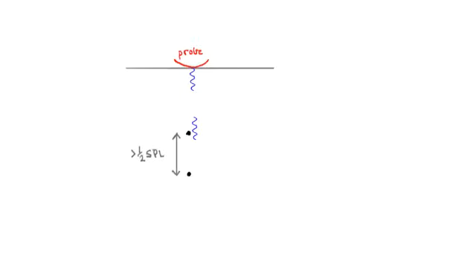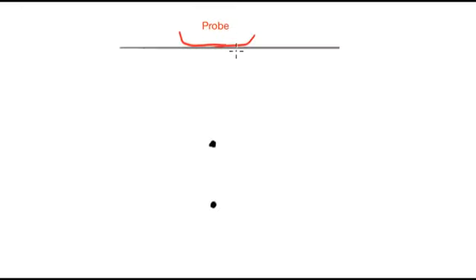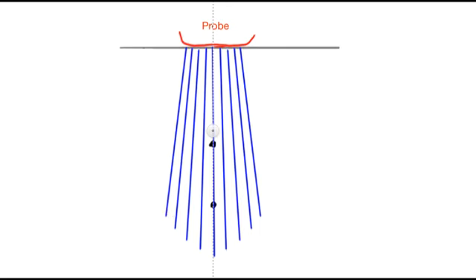Okay, so that's the basics of this. I still haven't told you how we make an ultrasound image. Maybe I never will. No, let me try. You can just imagine extending what we just talked about. Imagine taking many rays out of the probe in different directions. And if you could do that, then you could eventually build up a picture, especially if you had a computer to help you do it, which is what came into use in the 70s and 80s.